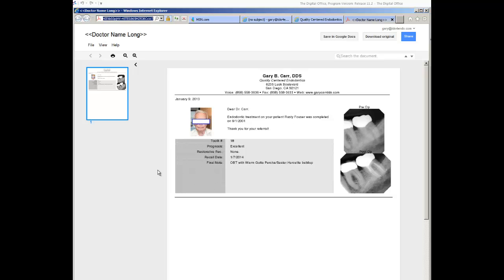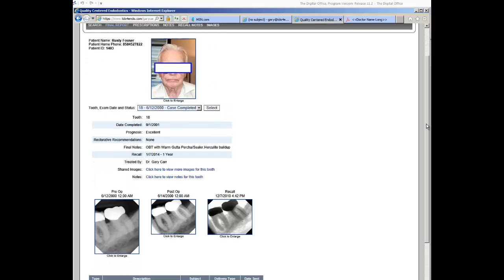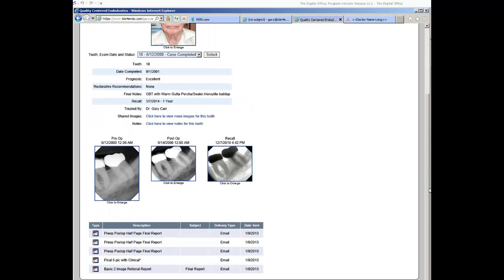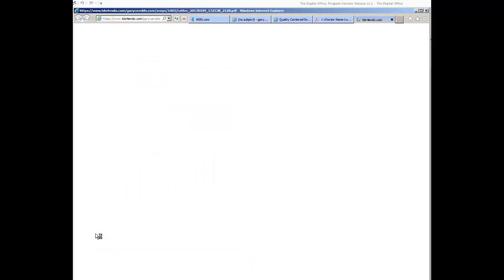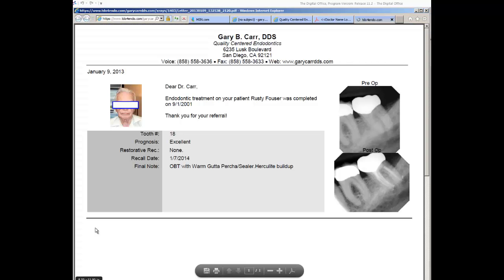This report is also available on the website. So when the referring doctor logs in to view the final case information online, which was shown in a previous tutorial, at the bottom of the webpage, there is a list of all reports that had been either emailed or printed for the referring doctor. And you can see the delivery method, the date the letter was sent, and the letter can be opened from here as well and can be printed for reference for the referring doctor.